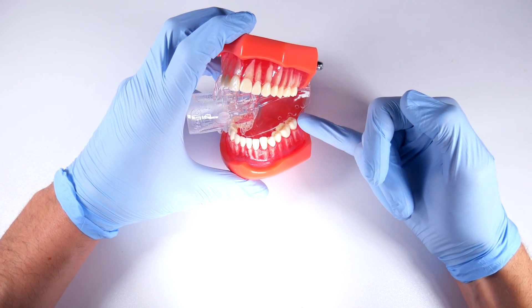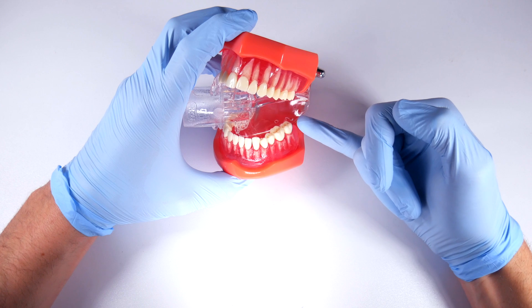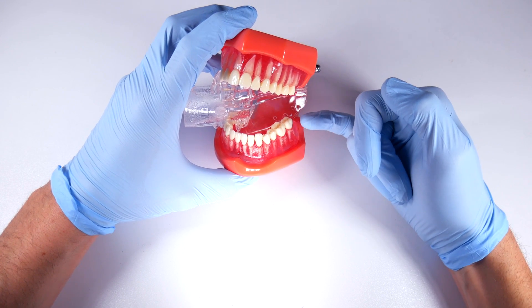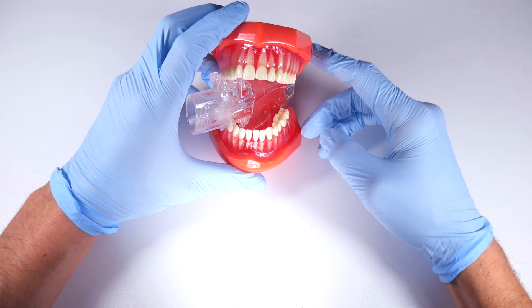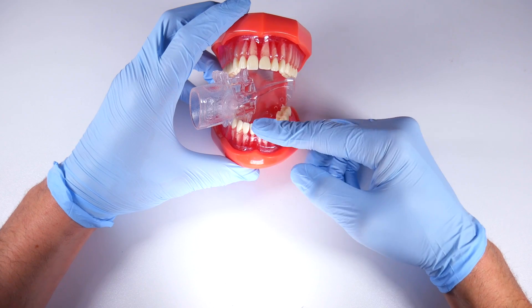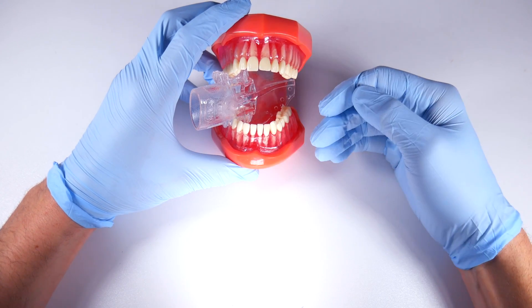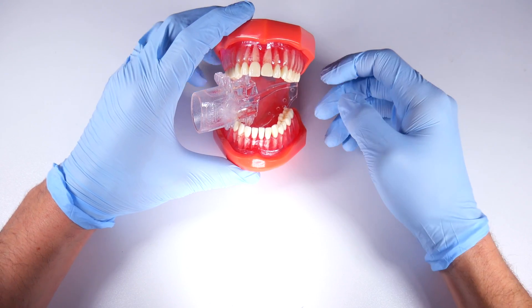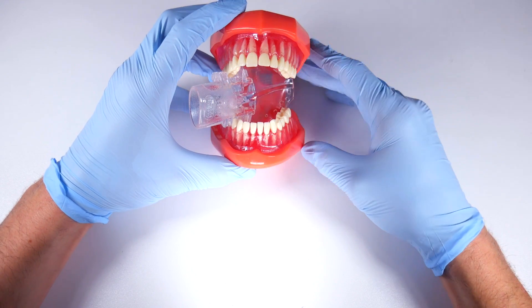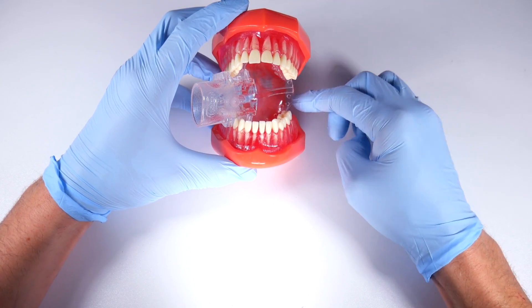Looking back into the third molar region, you still have great access to make that distal buccal releasing incision. You can reflect the tissue, get your flap open, and access everything back there — all the while you're not fighting the tongue and you don't have a big sweetheart retractor that can be dislodged or moved around incidentally when you're working. It's just a great tool.